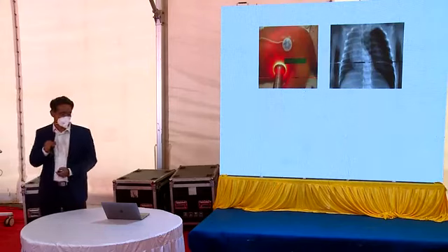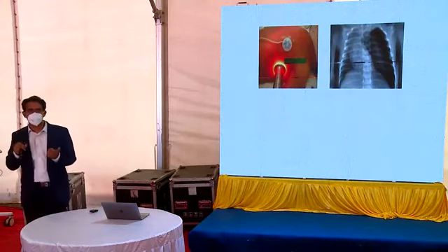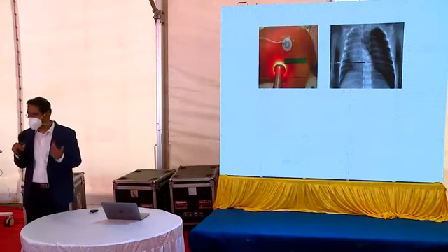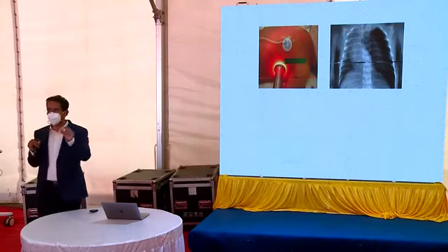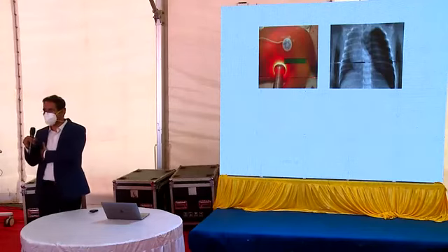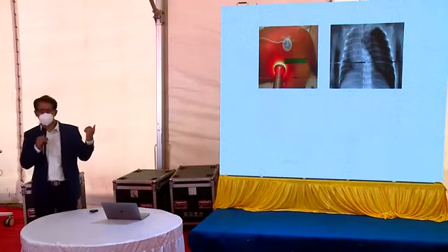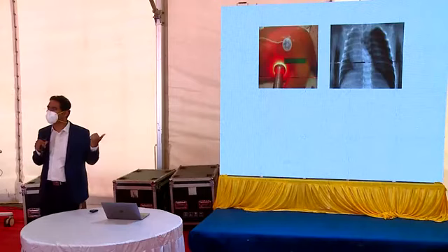Okay. So what do you think we should do? So one of the things that we can do is we can do a cold light test. Okay, so where you darken the surroundings, put a small torch, it should have a small footprint. You cannot have a torch with 10 centimeter, covering the entire chest. That cannot happen. So you put it and see how is the transillumination. So here it's one of the cases where transillumination test was positive.